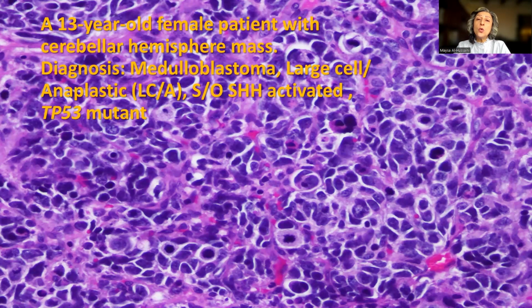Put together, you can, with confidence, subgroup medulloblastoma based on immunohistochemistry. Always remember to integrate the diagnosis with radiology, because there is a good correlation between molecular subgroup and radiological findings. I hope you find this tip useful in your daily practice.